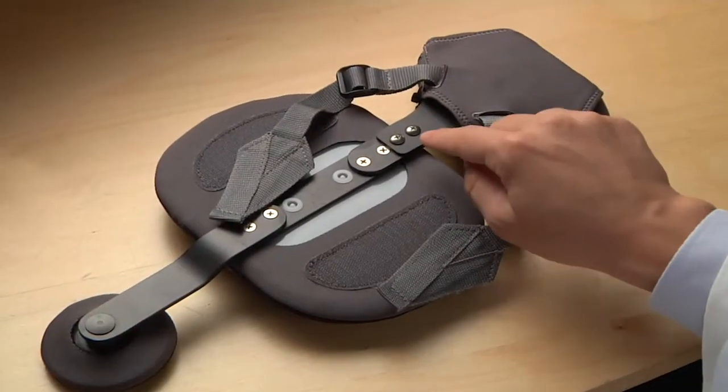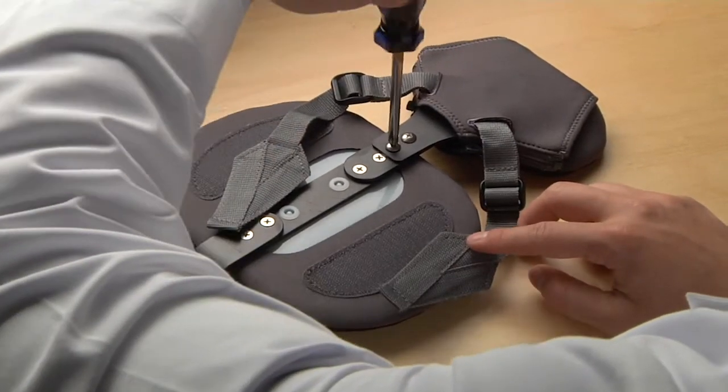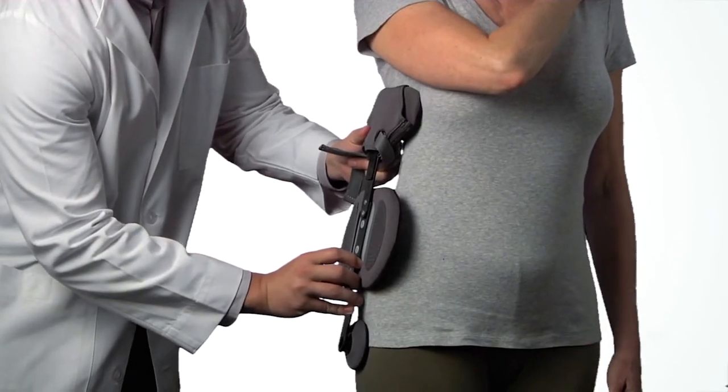To increase the height for this patient, use a Phillips screwdriver to remove the two screws that secure it. Position the thoracic pad as needed and reinstall the screws.